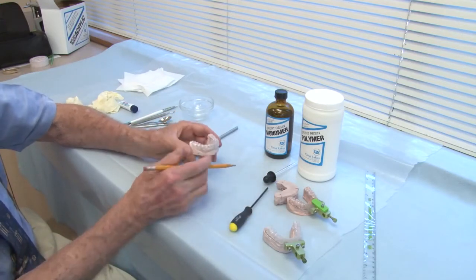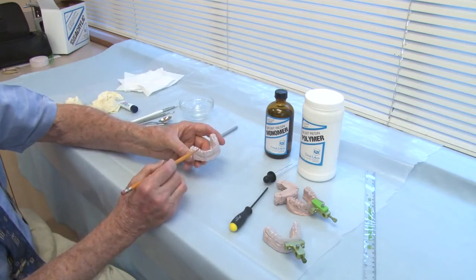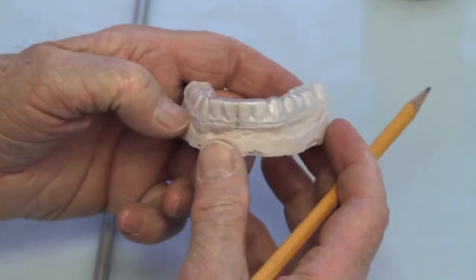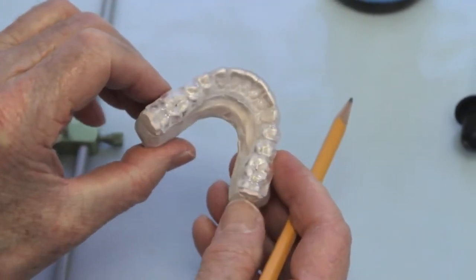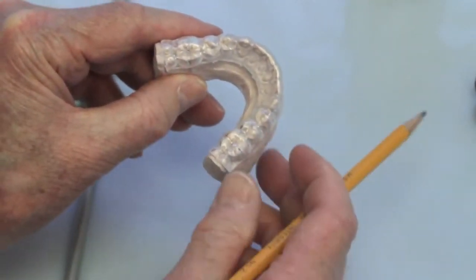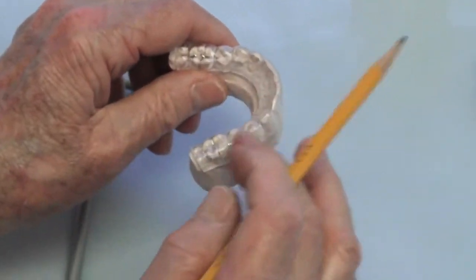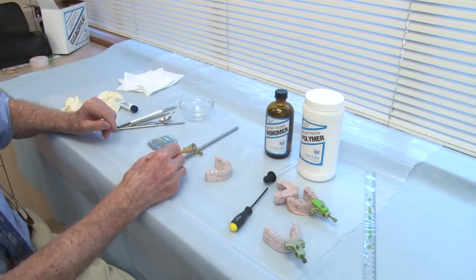I use 2mm Biocryl from Great Lakes, and I use the Biostar, and I adapt the Biocryl and cut off the excess at the cervical margins, buccal and lingual. Here they're extended back to the second molars, but I'll cut some of that off later. And now we're ready to begin to attach this Biocryl form of the lower teeth to our actual clutch assembly that we'll use on the patient.